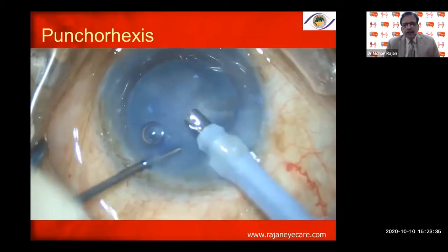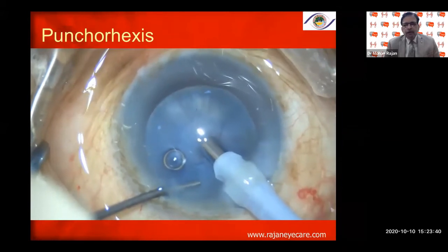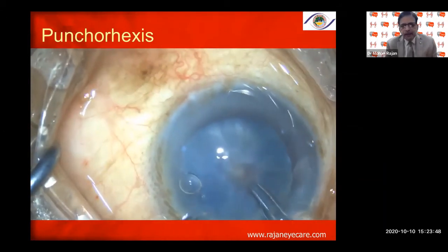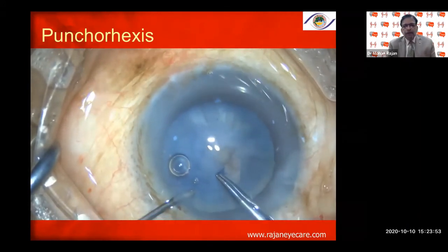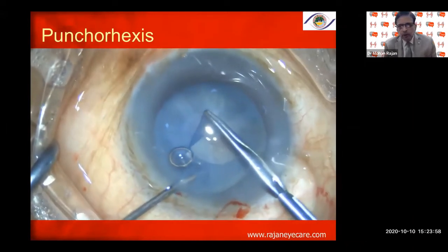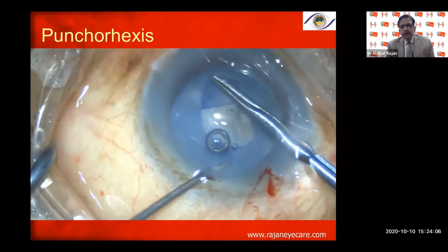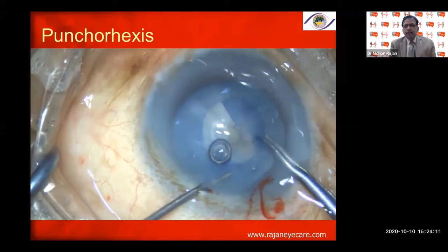The Puncho rhexis is a very simple technique. Just put viscoelastic like HPMC — no Healon, no Viscoat — go bevel down with the 15-degree blade, then punch the anterior capsule using very high vacuum of 450–500 mmHg on the Stellaris machine with faco power of about 50–60% continuous. Once you punch the anterior capsule, both the anterior and posterior compartments are taken care of, and the nucleus is also debulked.